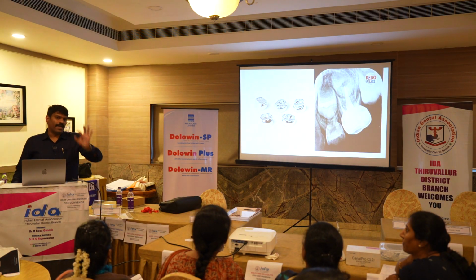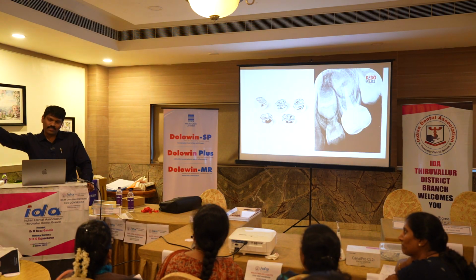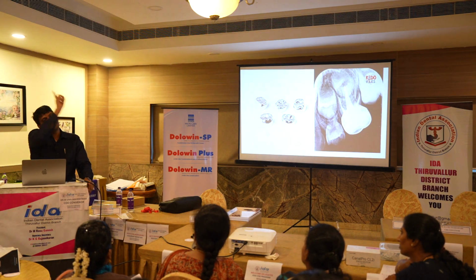Taper, the entire taper is different. You've seen ProTaper, right? First 3 mm there will be a taper, then it will progressively grow. It's called ProTaper. Next, uniform taper files, we call them constant taper, 4%, 6%. This is variable taper. Every mm of the file will be a different taper according to the primary teeth.